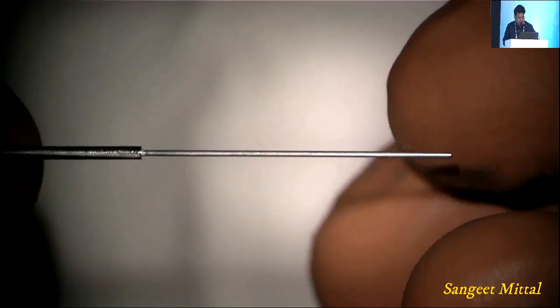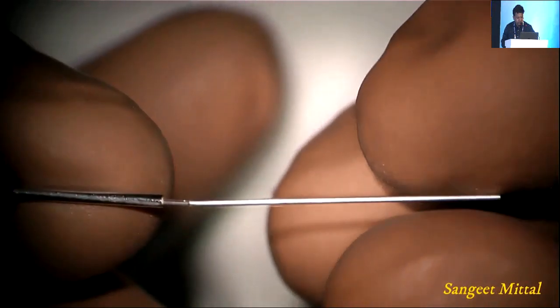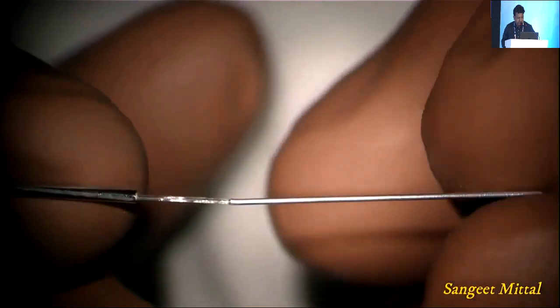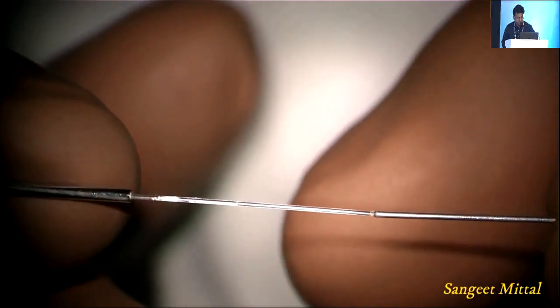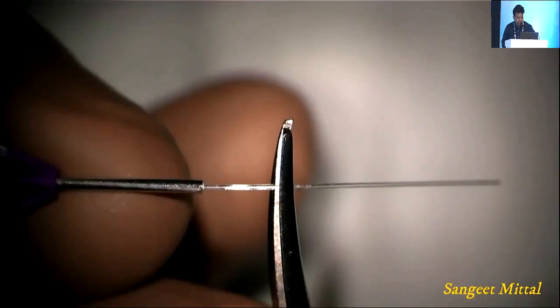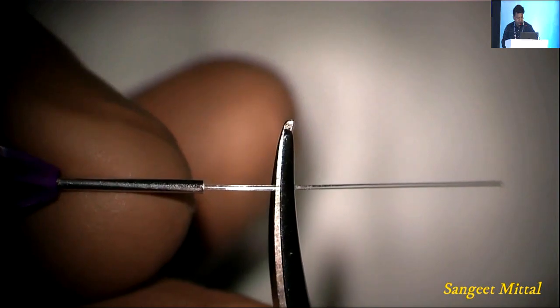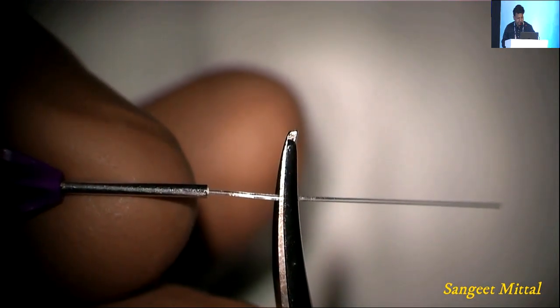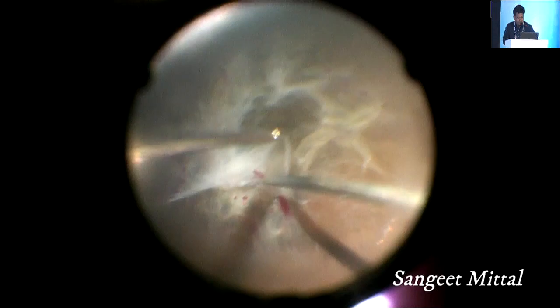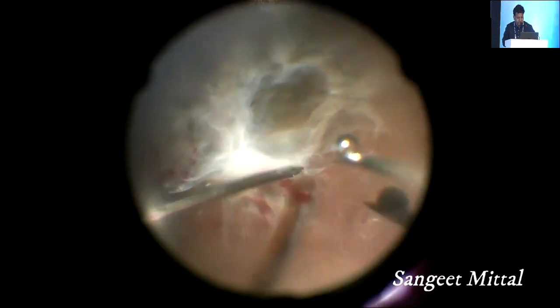Again, my method of doing bimanual dissection includes that I generally use a homemade chandelier. I remove this metallic strip over the old light pipes, and then it is stripped off, and then it is cut from the middle, and then it can be used as a chandelier. And this is the same patient, how we proceeded for surgery.